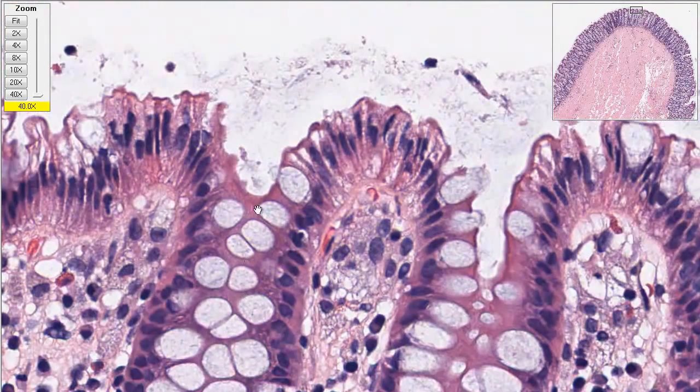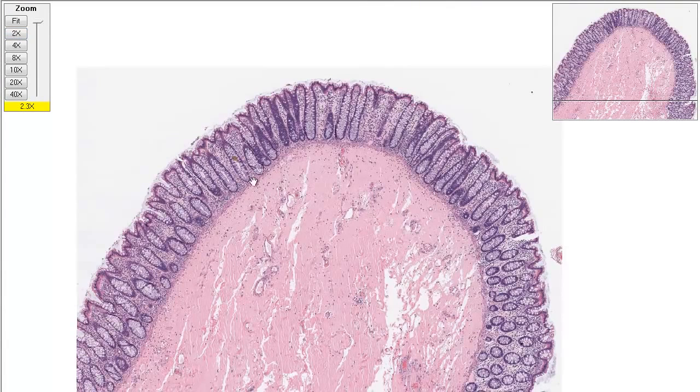Looking here, this is very well formed. You can see these tubular glands. Because they're like test tubes, sometimes they're not going straight up and down, and they look a little at an angle. But they actually are reaching the surface. We just don't see it based on the way it was cut. This one was cut at an angle, so it looks embedded there and two-dimensional, but in three dimensions we would see an actual tube popping out. We're seeing this because the section is only 4 micrometers thick and we're sending light through the tissue, so the cross section doesn't show you the three dimensions.